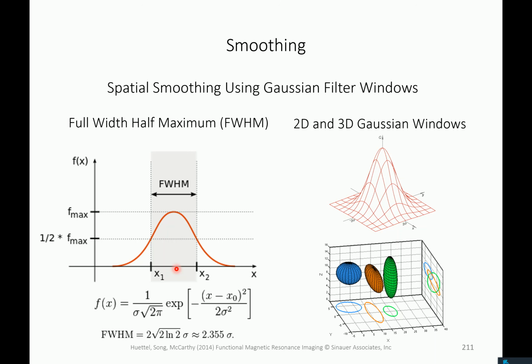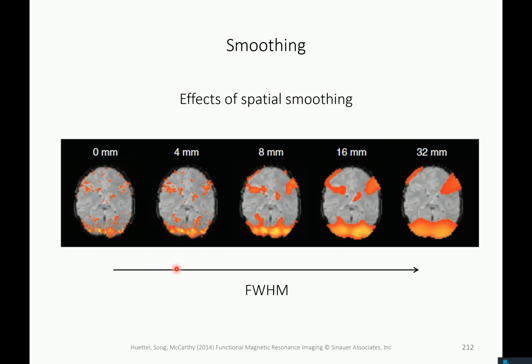It averages out noise, but you don't have a real noise model. For what you are saying to make sense from a probabilistic perspective, you would have to define your spatial noise in terms of a probability distribution and fit that based on the data. This is not what this is about. This is just about: there is some data, it looks like this, you do a spatial weighting by using a Gaussian filter window, and then the data gets smoother.